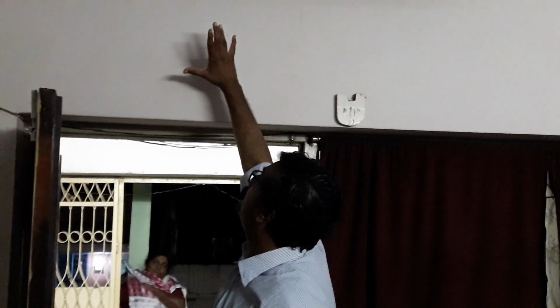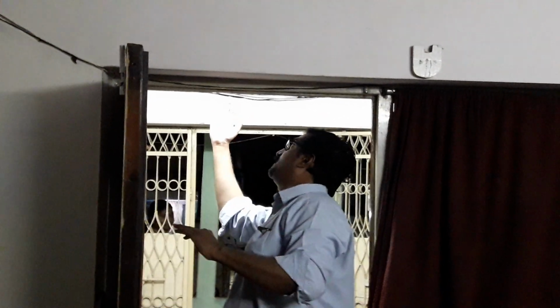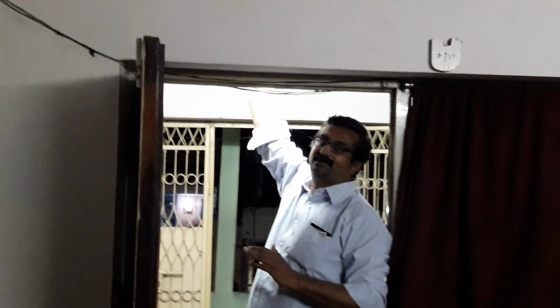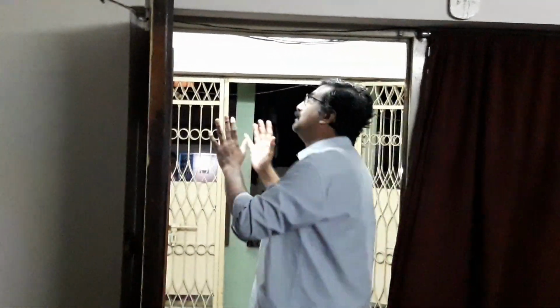This is a very important landmark. Even if you remove the anterior wall of the bulla, if you work posteriorly to this upper attachment, you may injure the anterior ethmoidal artery. If you work anteriorly, you don't injure the anterior ethmoidal artery, you will reach the frontal recess. So the intact bulla technique is very safe. If you work here, you can directly reach the frontal recess.